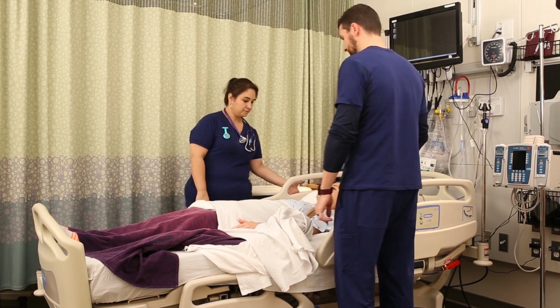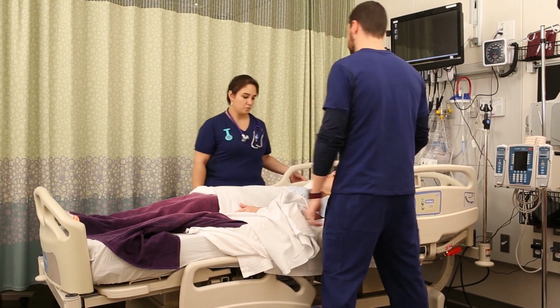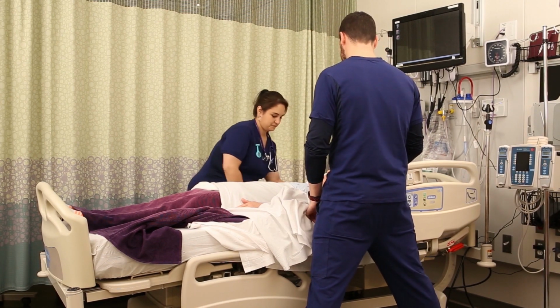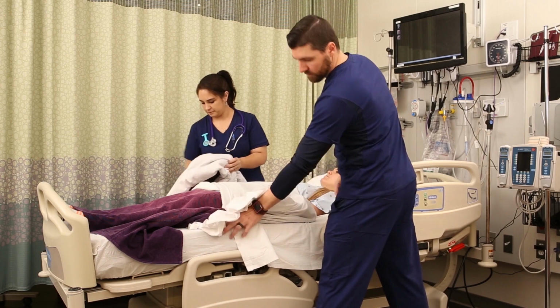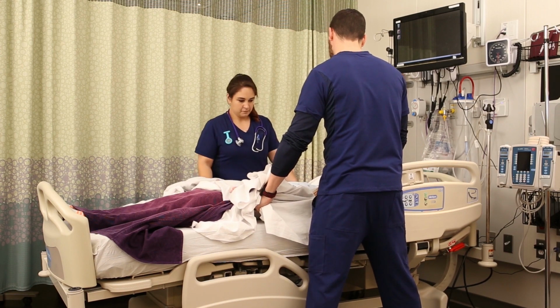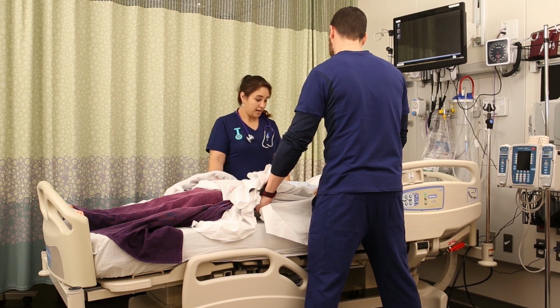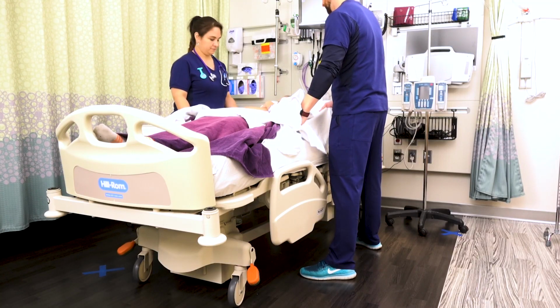Now, the whole goal here is to protect your back while preventing any friction and shear for the patient. So you and another colleague will stand at the patient's waist with the head of the bed flat and grab the draw sheet firmly. You want to have a wide stance with your knees bent and the bed at working height. You need to be able to step towards the patient's head, so make sure your feet aren't too far apart. Have the patient cross their arms over their chest and then tuck their chin to their chest. And of course, remind the patient to let you do all the work.